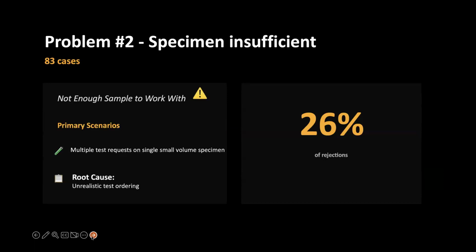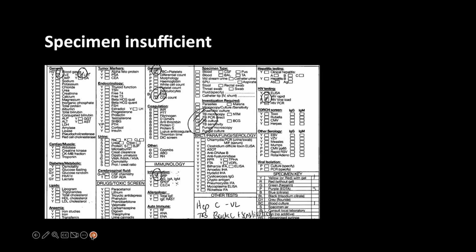So we see this a lot with CSFs, but on the next slide, there's a specimen that arrived with one yellow tube, as indicated by the lab personnel in the receiving office, and 3 purple top tubes. So the yellow tube was needed for a U&E, an LFT, and a CRP, which are processed in the same department and in the same site. So those could be processed together and there were no problems.